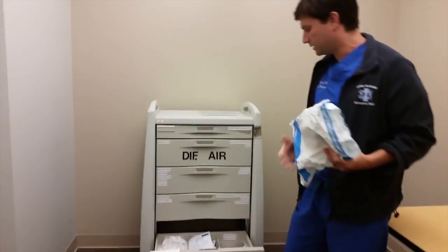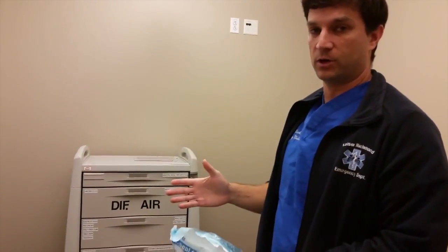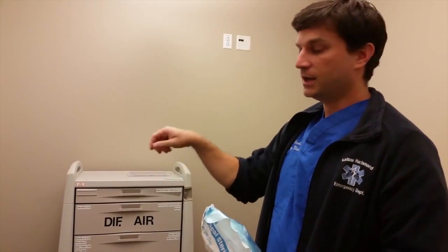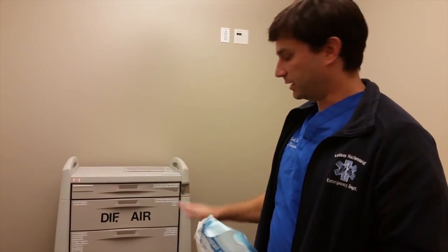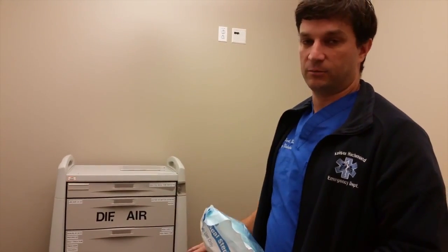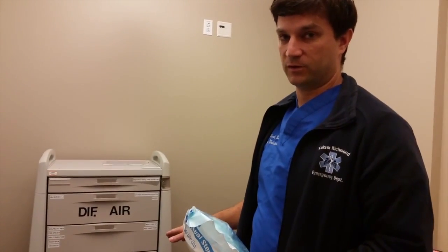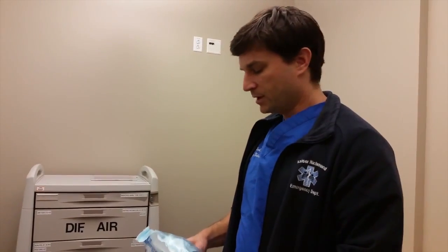The other parts, the adult wires and everything, are actually on the glide scope cart, which sits as a separate tower that has the video monitor on it, and the adult cables are already hooked up there. So technically, this is all backup supplies and part of rounding out the pediatric difficult airway part of this. The actual glide scope tower, with most of the adult stuff, is in a separate location just because it tends to be used as a first line for a lot of people.